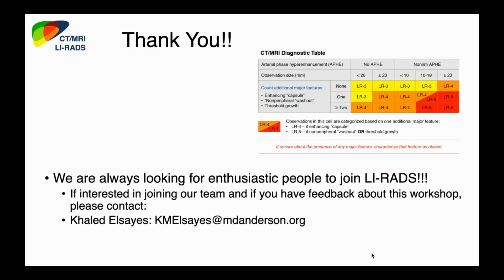The inside of the circle and the outside of the circle are the same color, but the circle is brighter. Again, it's uncommon, but it does happen. I wonder if you'd be at risk for Mach effect, where you think that the center is actually washed out because you see the bright circle next to it. Right, so that's one of the pitfalls, that your eye perceives washout when it's actually not there. But it can happen.